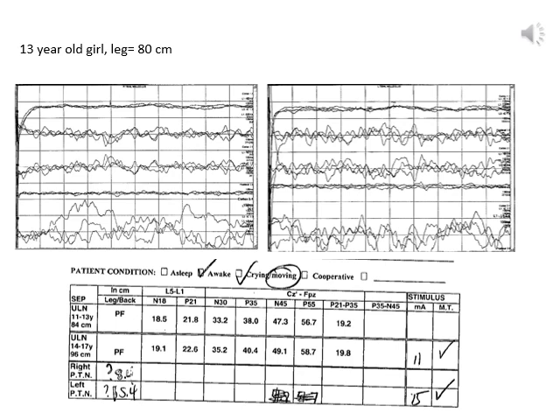What is really helpful for localizing dysfunction is to record both upper and lower limb SEPs and to look at the pattern of abnormalities that show up. And by looking at this pattern of abnormalities, we can start to localize where the dysfunction may be. And so I will demonstrate that in this next case.